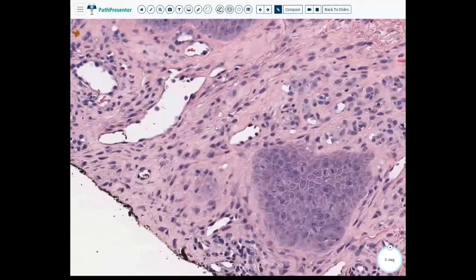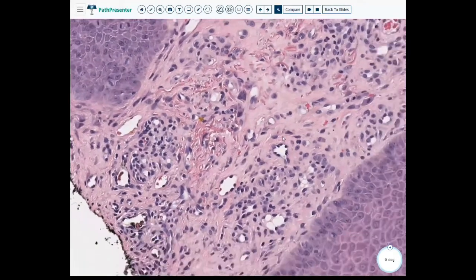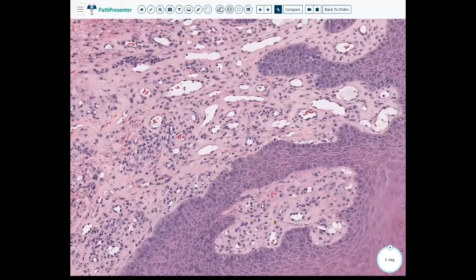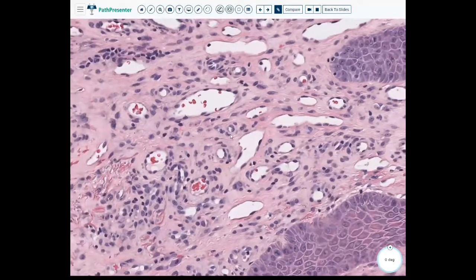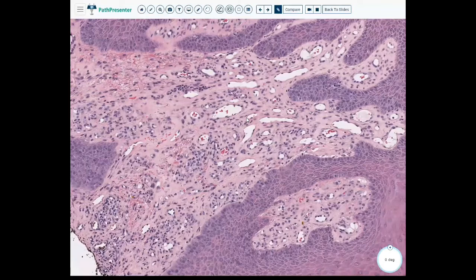And there's actually quite a few of them in here. More than a few. But that's okay, because that's maybe something else going on besides this lesion. Having all these plasma cells, and some of them are maybe a little funny looking, looks like a plasma cell as well. So that would be a dermal plasmacytosis.